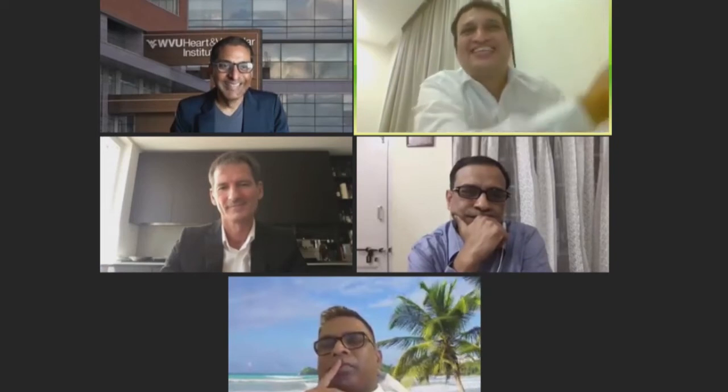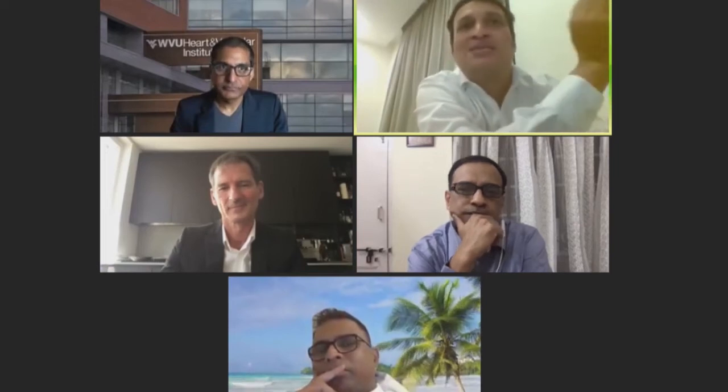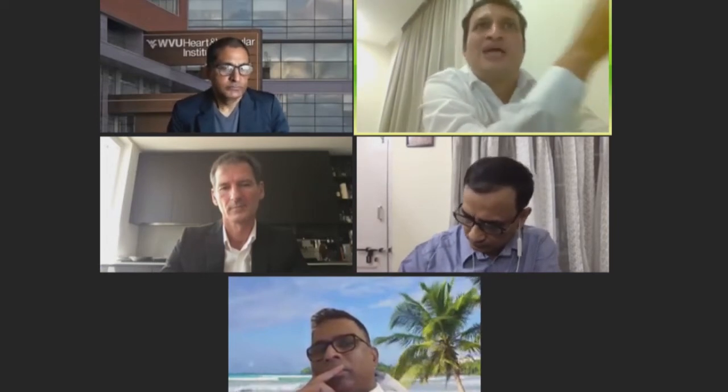Yes. Thank you, Dr. Ajay. I think most of it you have answered already. So I think the first step is to shift. Yes, I never do a NOAC. I agree with you completely. I may not even shift them to warfarin. I just stop the NOAC for 2 days, because in most AF, if it's non-valvular AF, even if they're undergoing a dental extraction or some other procedure, we don't bridge them. So I typically stop the NOACs and do a TEE on table and just continue the procedure.